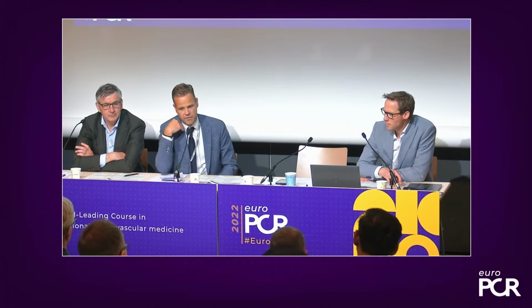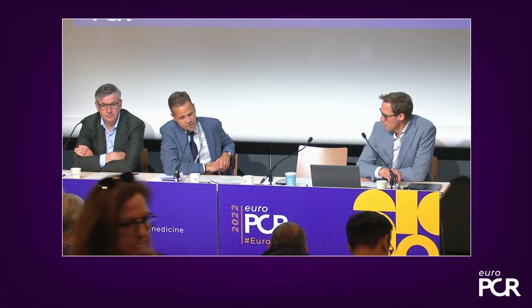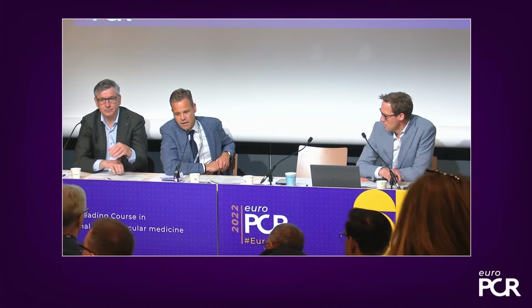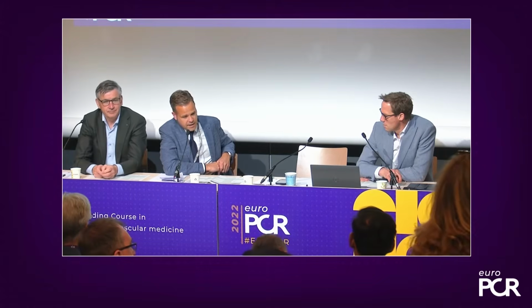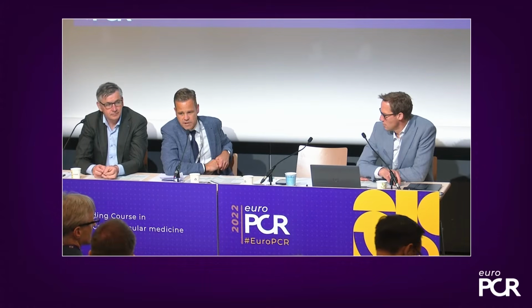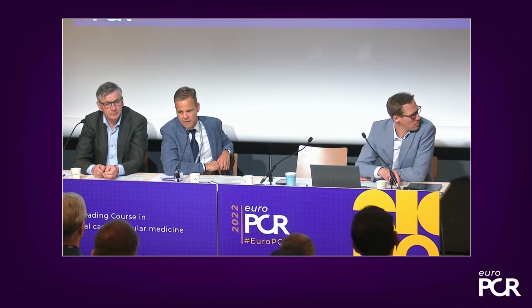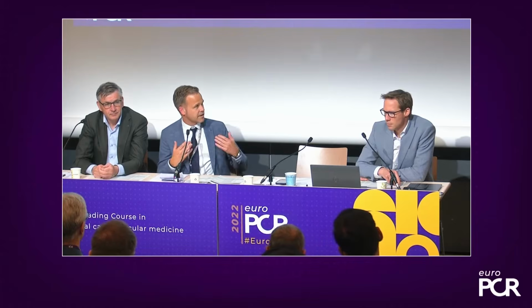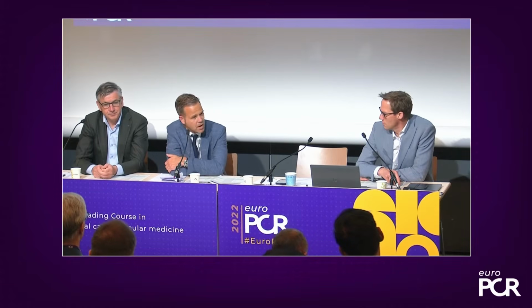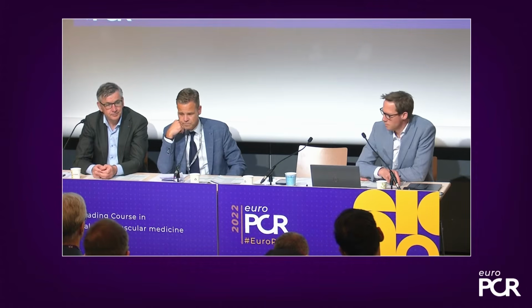Now we move forward, and we do definitely see the benefit of doing a CT up front. It gives you a lot of information. You can plan your procedure. You can see the anatomy of the left atrial appendage, and it helps you understand what you're looking at, and already helps you decide what kind of device you're going to use and where you're going to implant it. Especially with simulations nowadays, things are going to help us optimize the procedure up front. So I think imaging is really crucial.